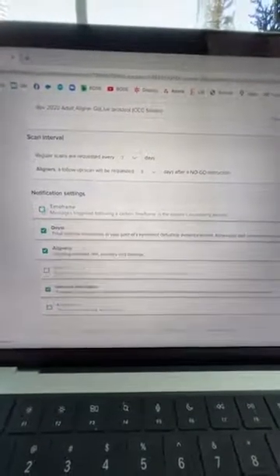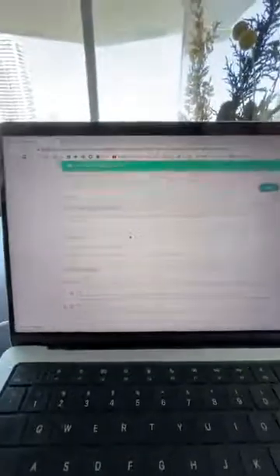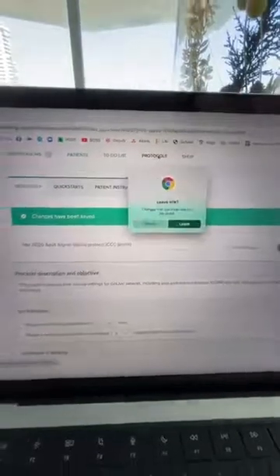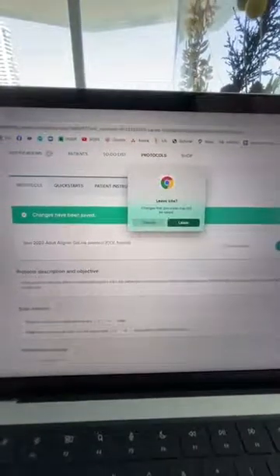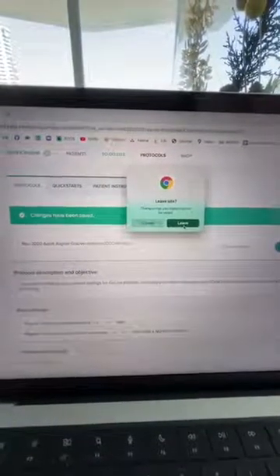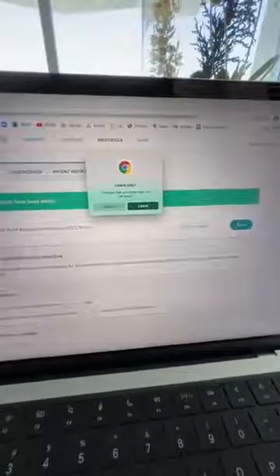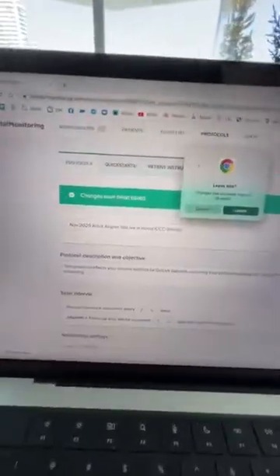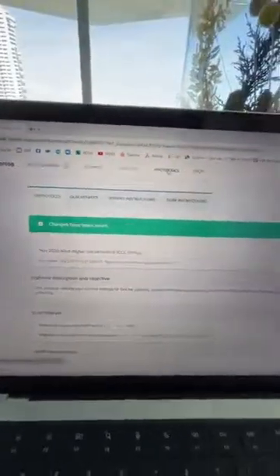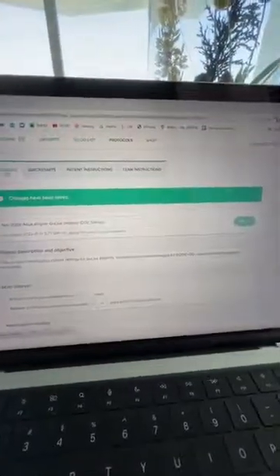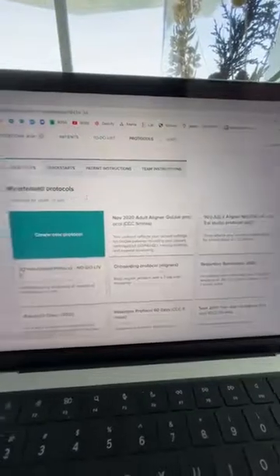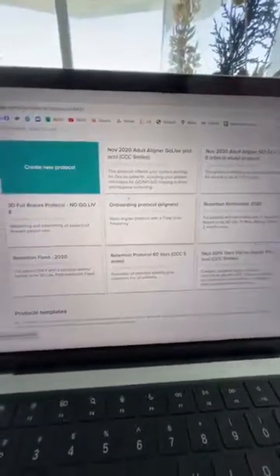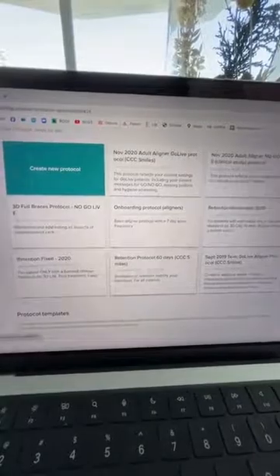Currently I'm going to turn it off, but basically this is how you set up a protocol. Once I save it, you have the ability to create as many protocols as you want. If I go into my protocols you can see we've got quite a few protocols already made up here and you can easily assign each protocol to a patient.